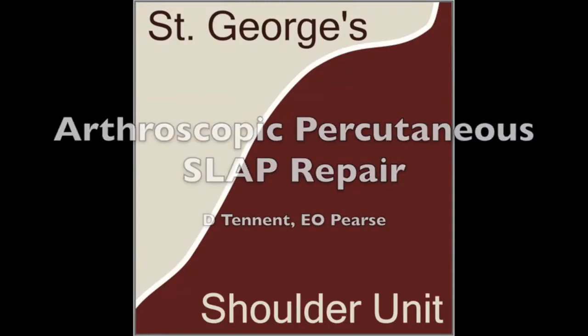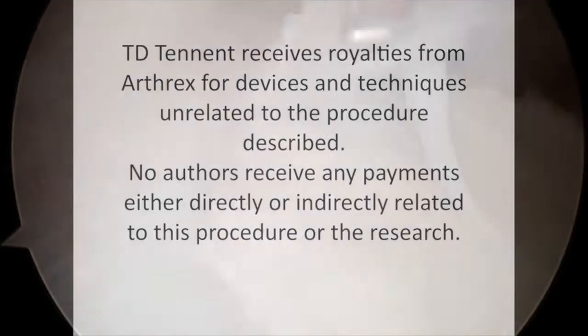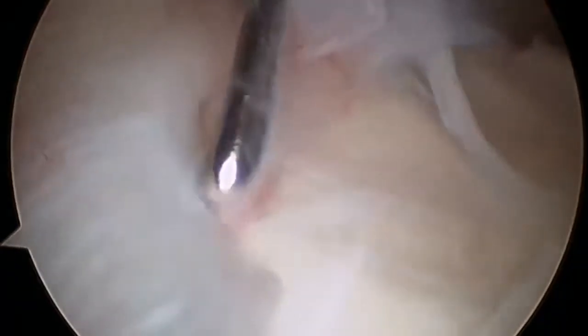Percutaneous mattress repair of a superior labral lesion. In this right shoulder in the lateral decubitus position, the superior labral tear can be clearly seen.